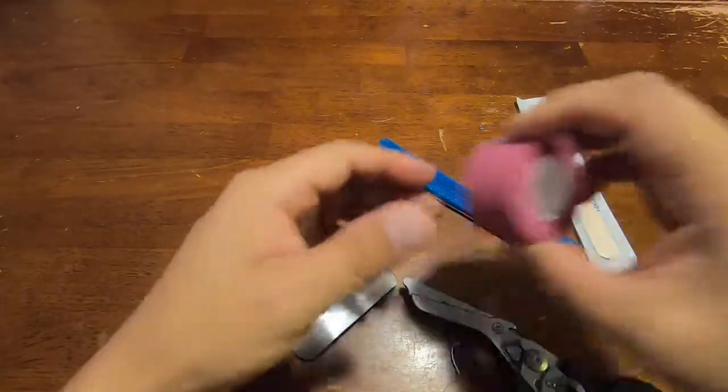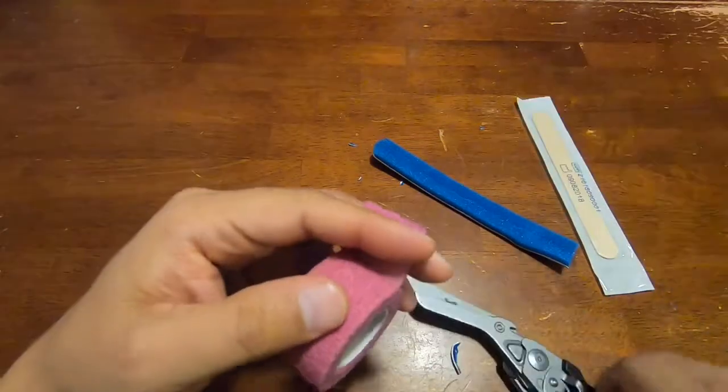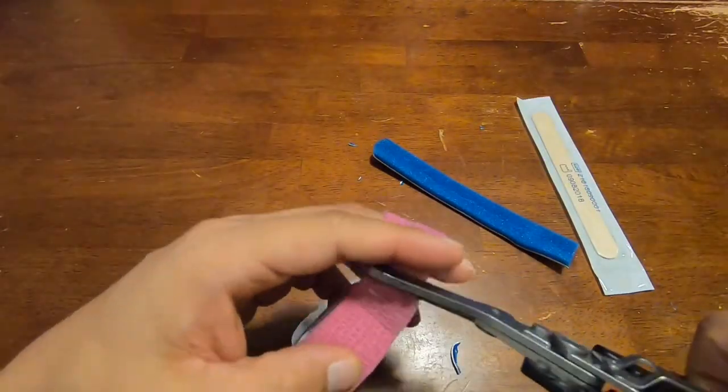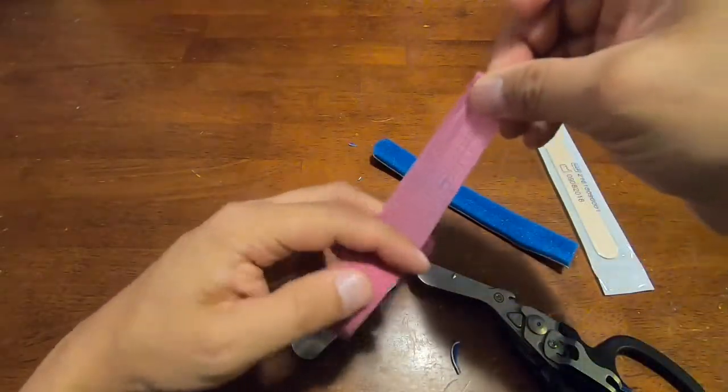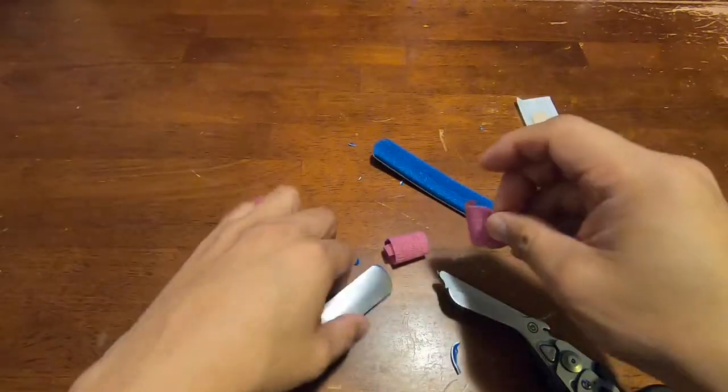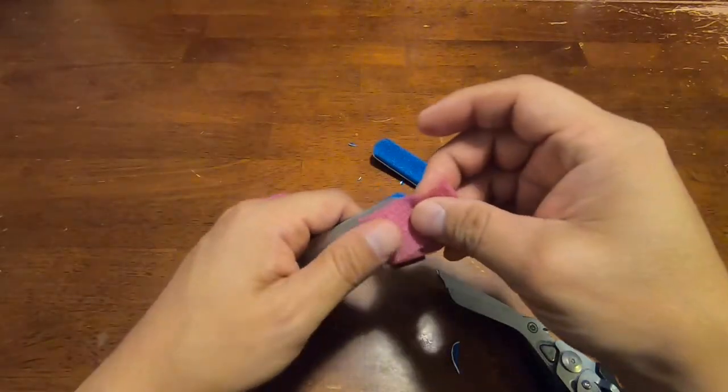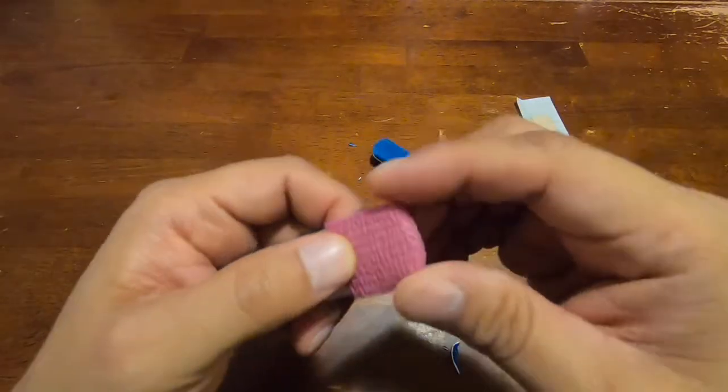And then what you do from there is grab your Coflex or your Coban and cut a couple of pieces, shorter pieces.